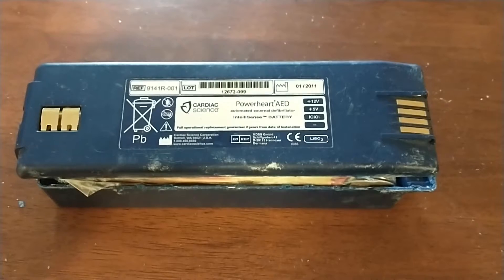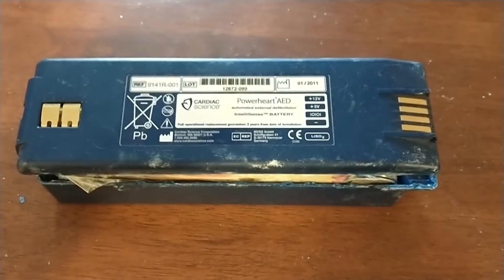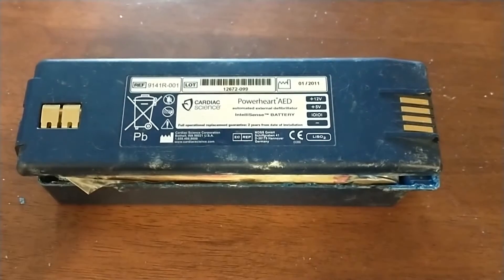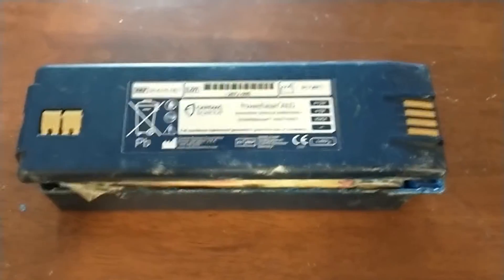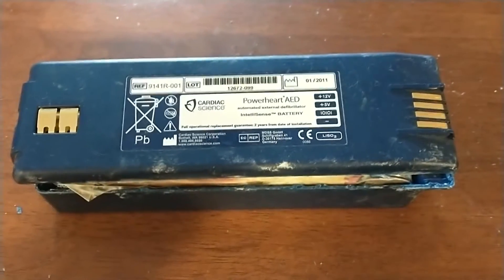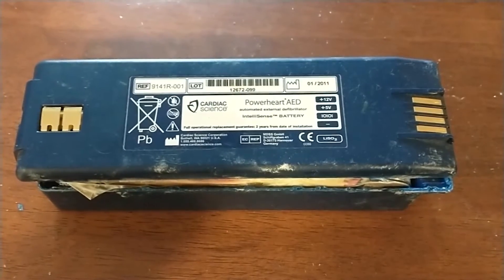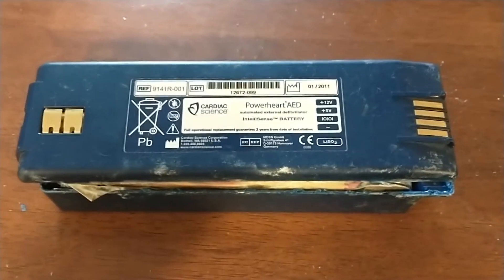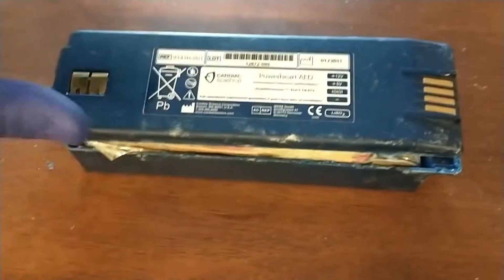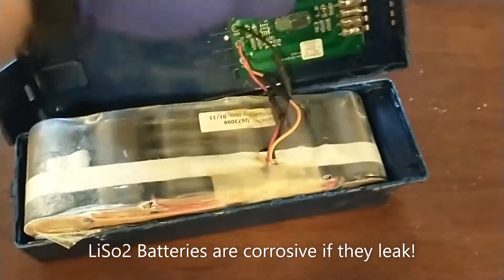Here we have the latest project I'm working on — something I probably shouldn't be playing with but I'm going to anyway. It's the battery out of an automated external defibrillator. It went dead and you can't buy these batteries anymore. The one you can see here is dated 2011, so it's ancient and dead. I popped it open here — I've got gloves on in case there was any leakage.